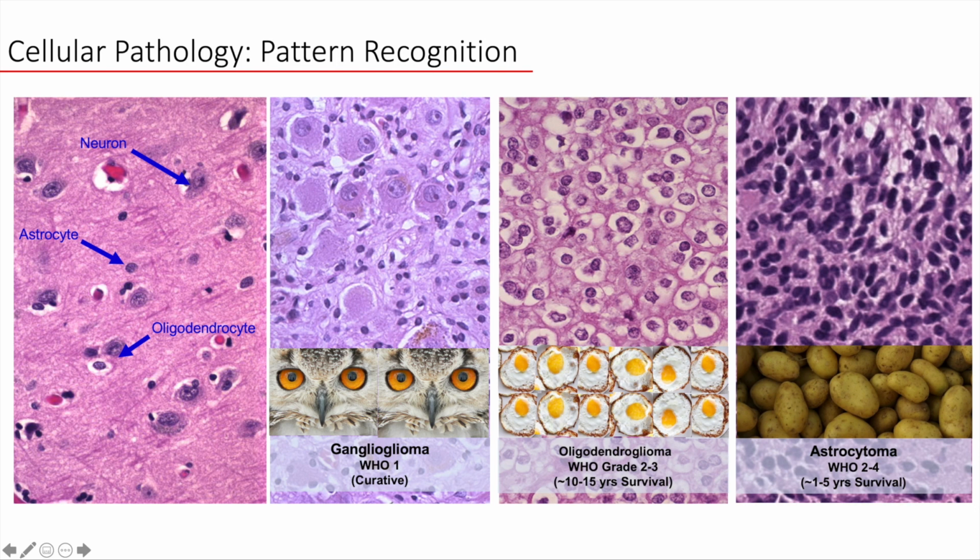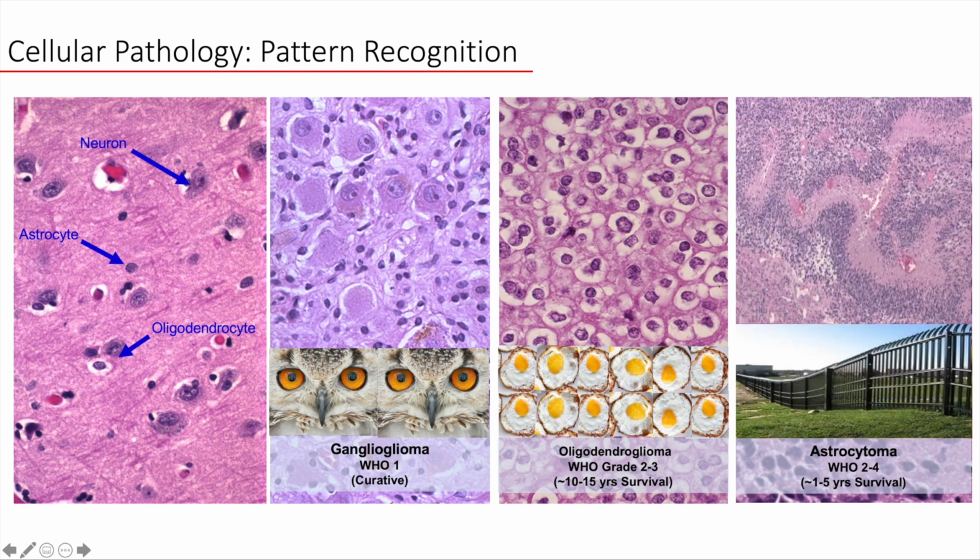Now, this is an example of interpatient heterogeneity and patterns that, again, have prognostic significance. There's, of course, also intrapatient heterogeneity that we may see within a tumor. This is an example of palisading necrosis, where we see the cells accumulate around an area of necrosis, and what we're in fact seeing right here is a hypoxic area of the tumor.